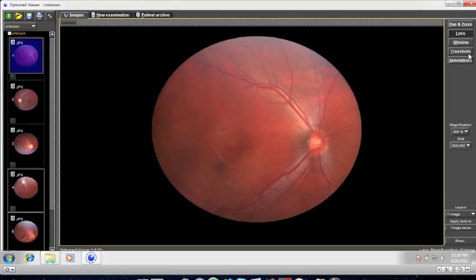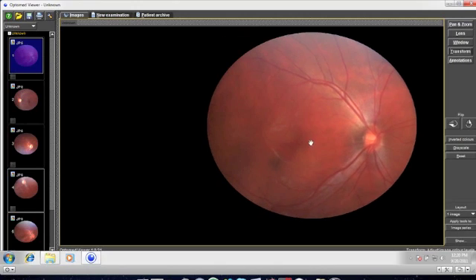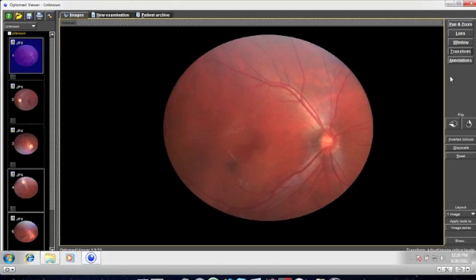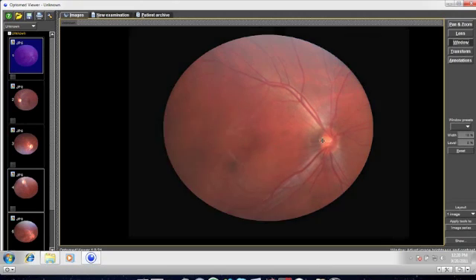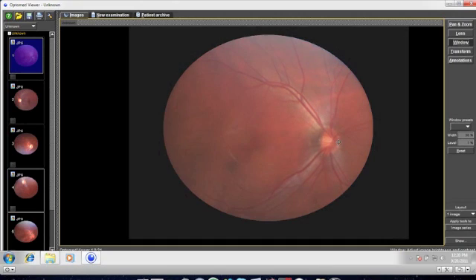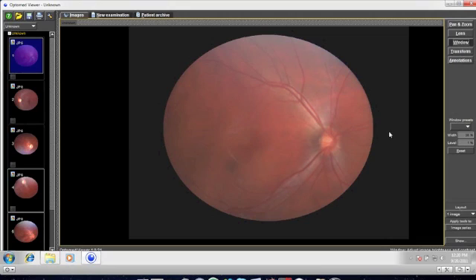Window allows the user to change the contrast of the image. If the image is originally quite bright, which is something you will find if using a strong illumination level, then you can play with the contrast until the image colours are improved. For example, the original image was this colour.